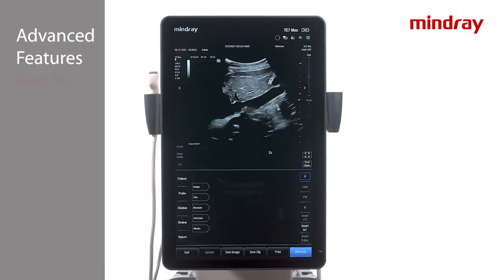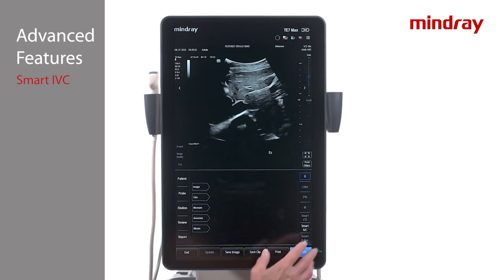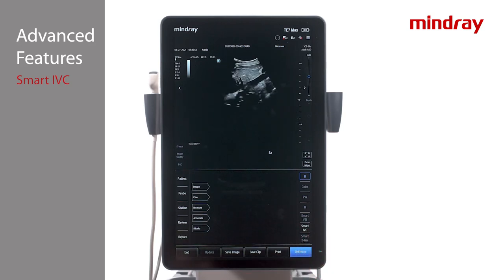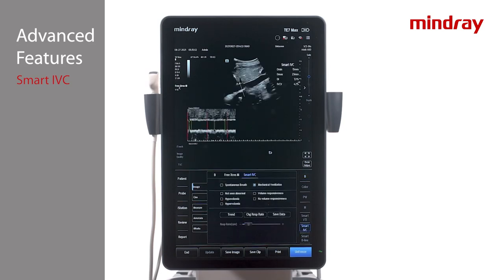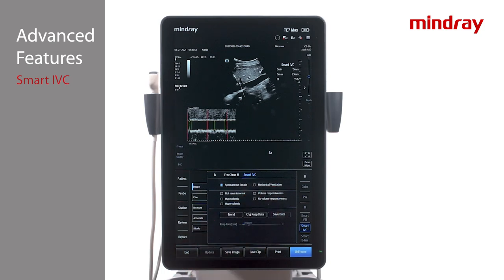Smart IVC is a software option used to automatically trace the IVC diameter changes and calculates the collapsibility index for spontaneous breathing and distensibility index for mechanical ventilation. Smart IVC can be performed on real-time images or stored clips. To calculate during real-time imaging, scan the IVC in the long axis plane and press the Smart IVC button on the lower right portion of the screen. The system will automatically locate the IVC target area, track and measure the change in IVC diameter. Select spontaneous breath or mechanical ventilation in the lower middle portion of the screen under the Imaging tab.